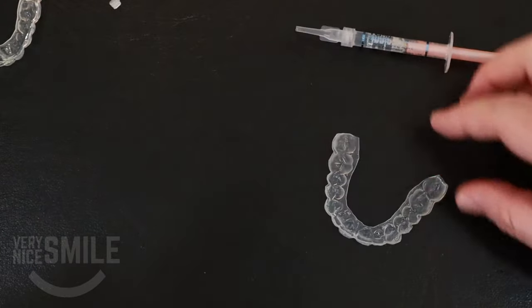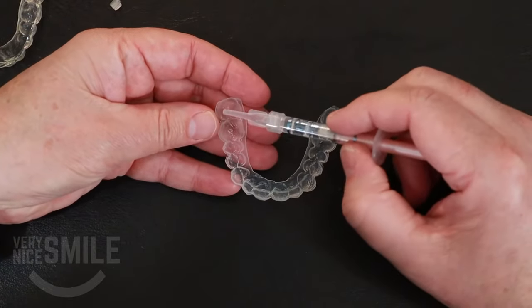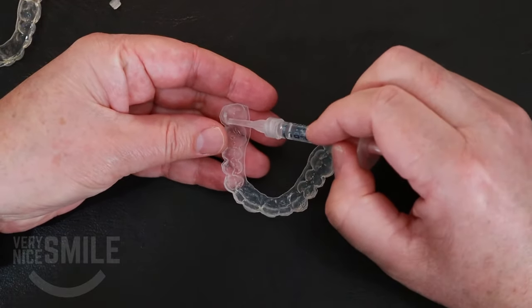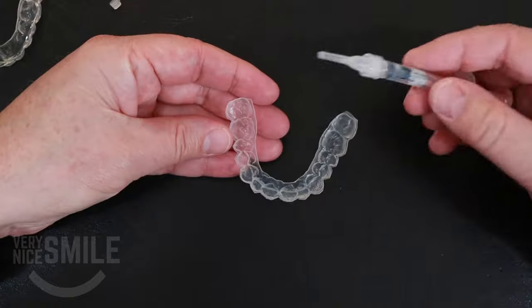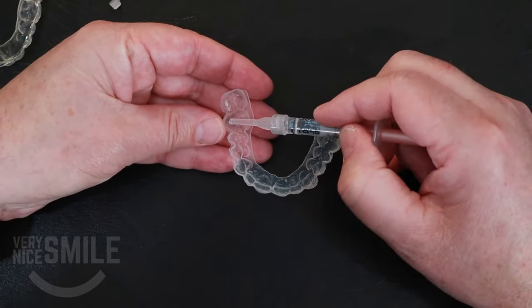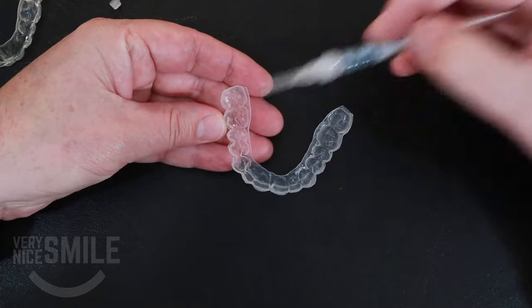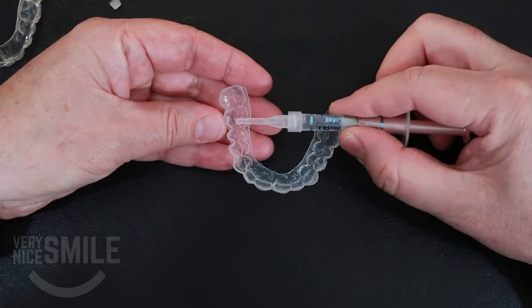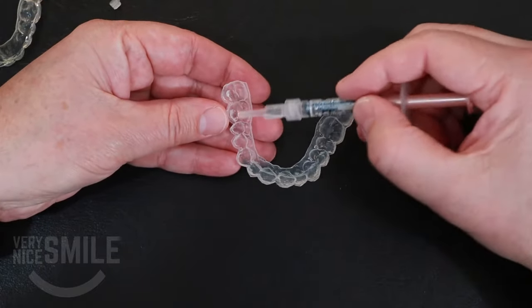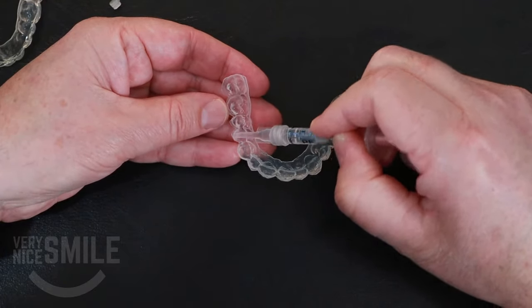A second technique — it's a little bit harder to do, but you don't use as much gel — is for the outside, just put like a little blob, just a little dot of bleaching gel. What makes this tricky is because the gel is a little sticky; you've got to put the tip on the outside there, squeeze a little blob of it out, and then you've got to rub the tip of the syringe to kind of break the gel off, so it doesn't pull back out. You just do a little dot on each tooth.